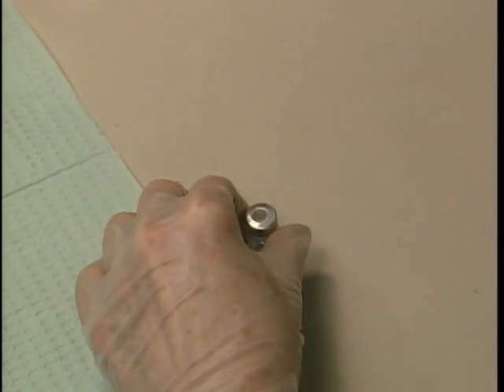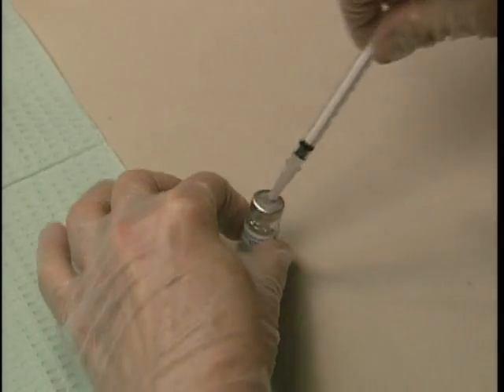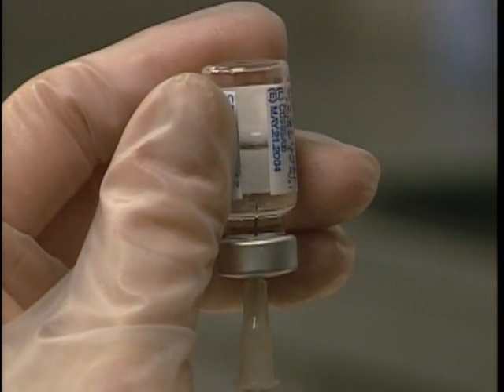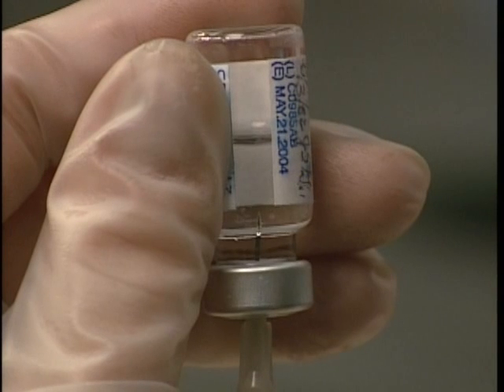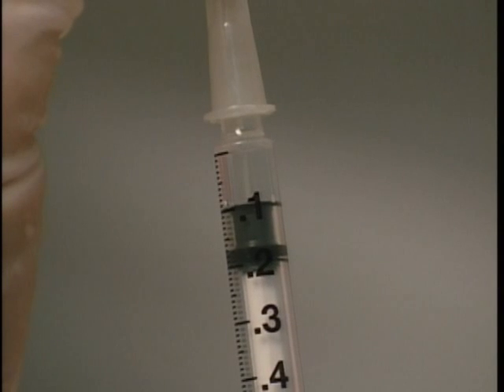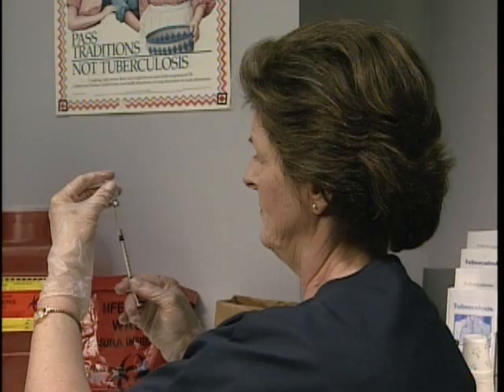Place the vial on a flat surface. Hold the vial between the thumb and fingers, and insert the needle through the neoprene stopper. Invert the vial while keeping a firm hold on the syringe and plunger. The tip of the needle should be below the fluid level in the vial. Pull back on the plunger and draw out slightly more than the 1/10 of a milliliter needed for the test.